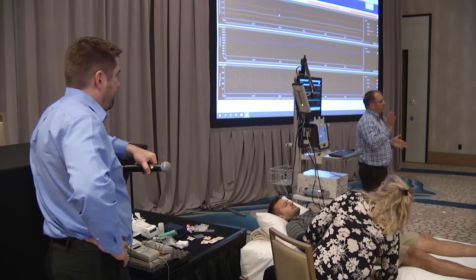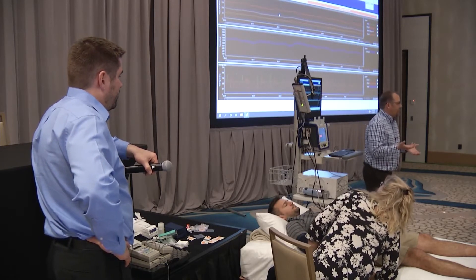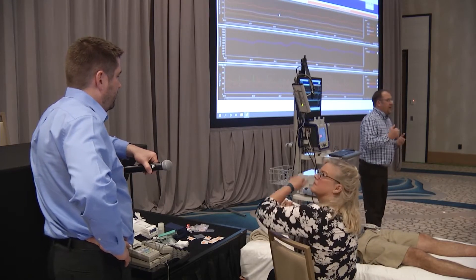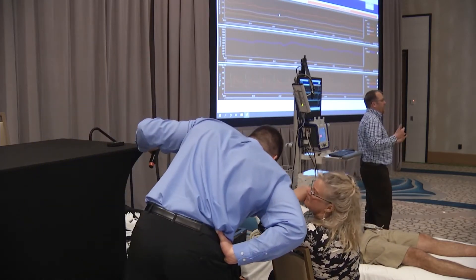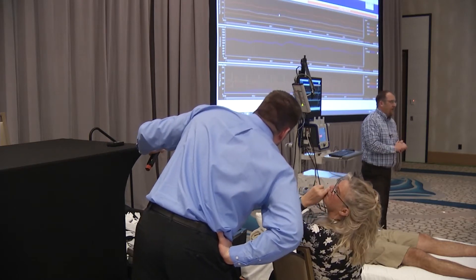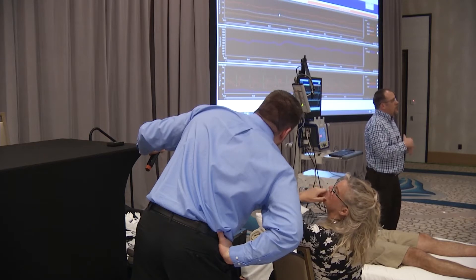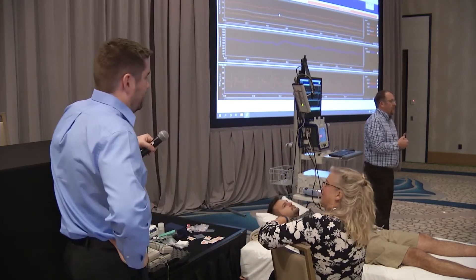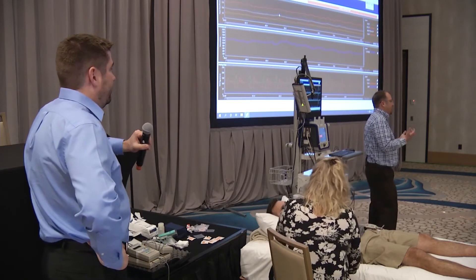We take a baseline blood pressure just before tilting them up, then once tilted we take at 30 seconds, one, two, three minutes, then five, seven, and nine minutes depending on how long the tilt is. Then we return the patient to supine, let them rest for three minutes, and normally take one blood pressure before releasing them to be sure any abnormalities have returned to baseline.